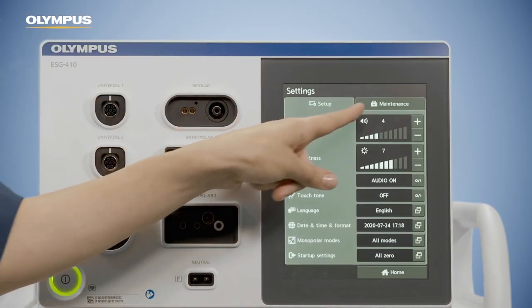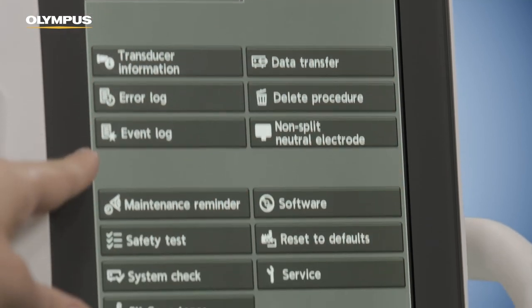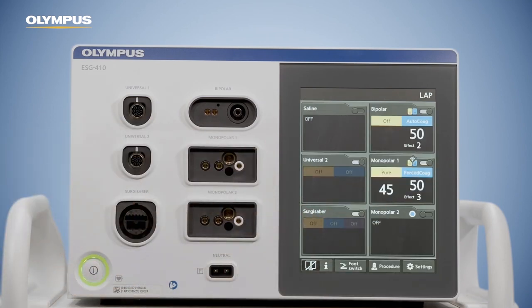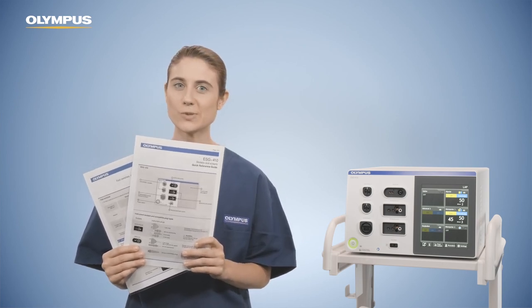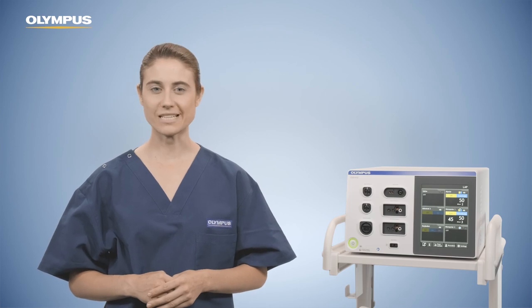The Maintenance tab in the Settings screen provides more setting options. The six buttons on the upper pane are for use by nurses and physicians, while the lower seven buttons are intended for maintenance or service personnel. The Home button leads you back to the Home screen. If you need further guidance, please refer to the instructions for use. Quick reference guides are also delivered with the ESG 410, giving an overview of footswitches, sockets, plugs and different screens. You have now completed the ESG 410 in-service video. Thank you for your attention. Please contact your local Olympus representative if you have any further questions or wish to have more detailed information.